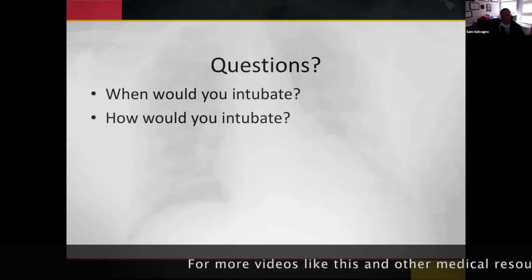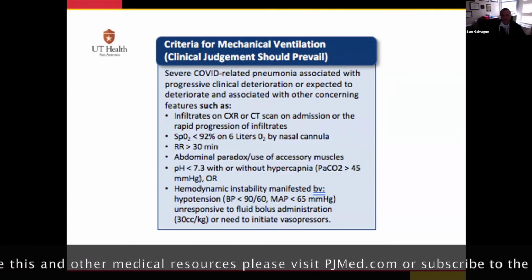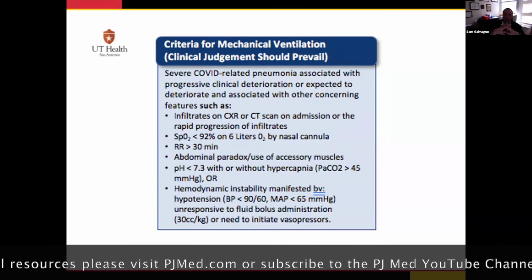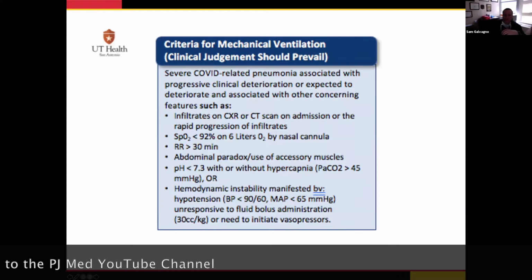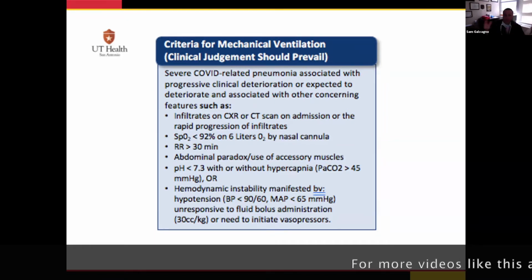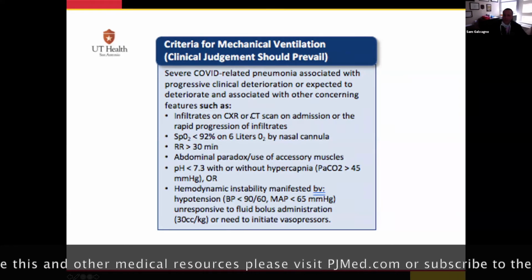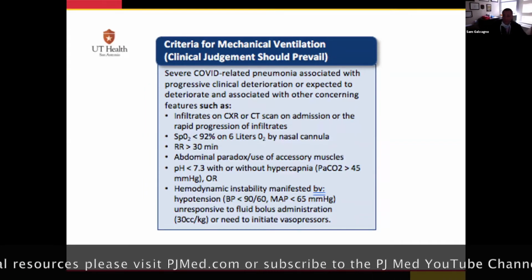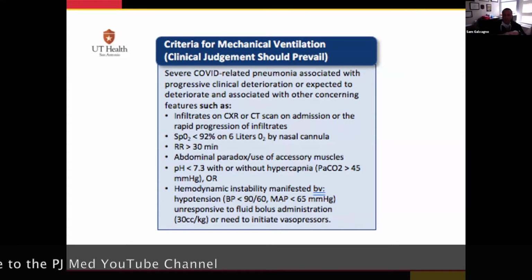So let's say that here's what the UK folks are putting forth in terms of when you should intubate someone and put them on mechanical ventilation. So first of all, making sure that they have a COVID pneumonia. So we do need to diagnose this. We've got to get the test done because it may be something else that we can reverse, right? The infiltrates, like I showed you. If you have a CAT scan, you might hear your guys talking about CAT scans because I showed you a couple previously, but it's the rapid progression of infiltrates.